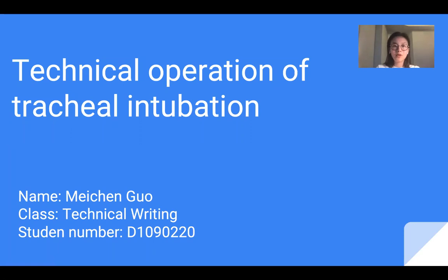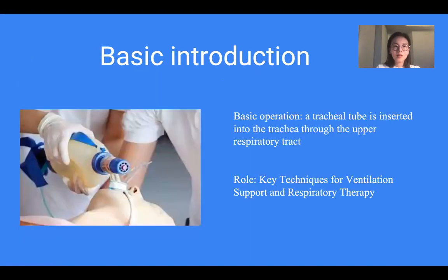Today, my presentation is about the process of technique operation of tracheal intubation. So, we have heard about tracheal intubation as a medical treatment in many medical movies, right? Specifically, it's a medical operation in which a tracheal tube is inserted into the trachea through the upper respiratory tract to ensure the patency of the airway.